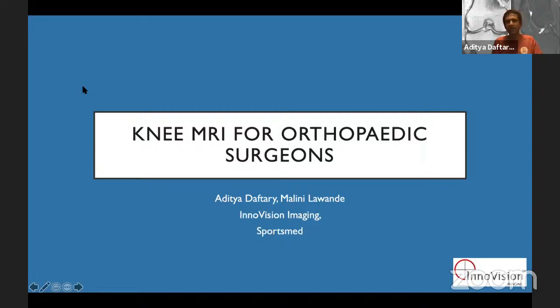I don't see great value in those situations. I think the great value of a cartogram lies possibly if you want to know the character of the cartilage defect and the adjacent cartilage, if you're planning to do a cartilage reconstructive surgery, and if you have a post-reconstructive cartilage reconstruction patient in which you want to see, is this cartilage incorporating well with the rest of the cartilage?